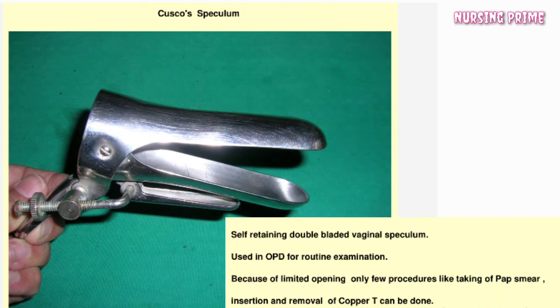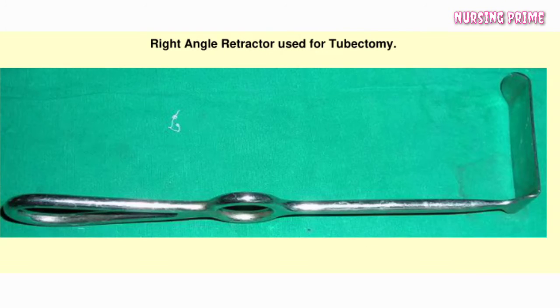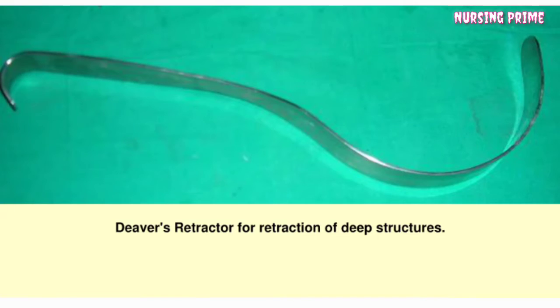Because of limited opening, only a few procedures like taking a pap smear, insertion and removal of copper T can be done. Doyen's retractor. This instrument is used for retracting bladder during abdominal operations like LSCS, abdominal hysterectomy, laparotomy. The smooth edge and the curvature retracts the bladder and protects it during surgery. Right angle retractor used for tubectomy. Deaver's retractor for retraction of deep structures.